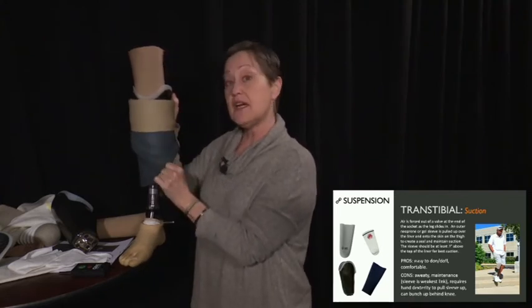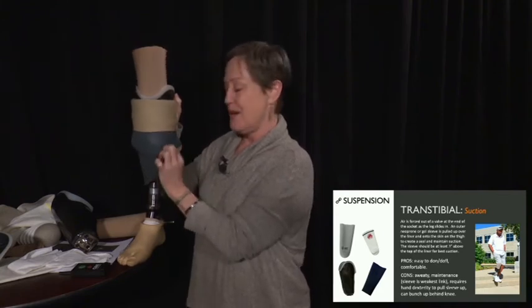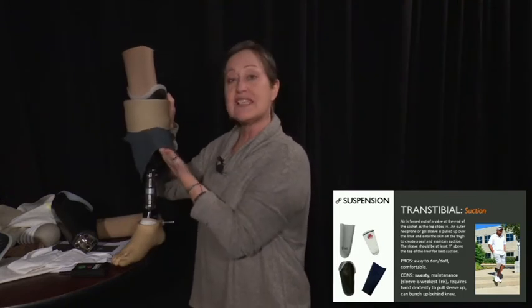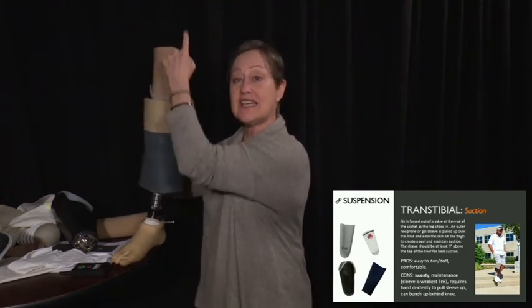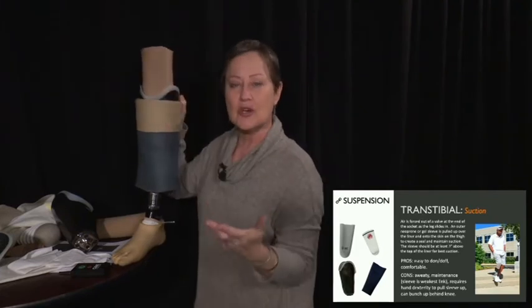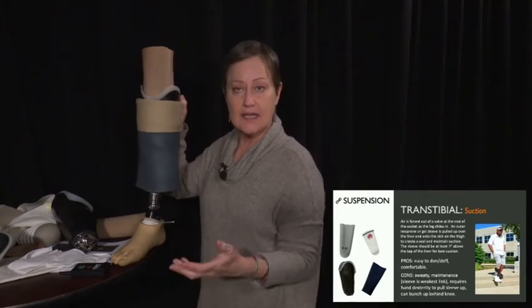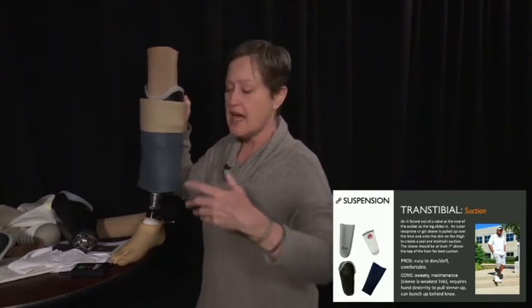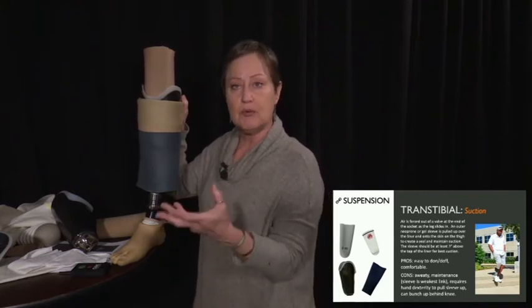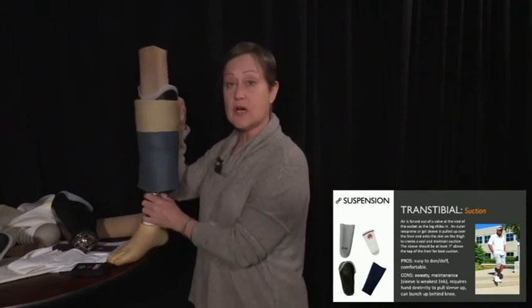The whole trick here is that you need to have a significant amount, and by that I mean at least 2 or 3 inches of sleeve on skin above the liner. That's your closed system for suction. Air can't get in, air can't get out. Patient takes a few steps, that forces the rest of the air out of the one-way valve. Boom, you have your suction suspension. So that's the general concept.